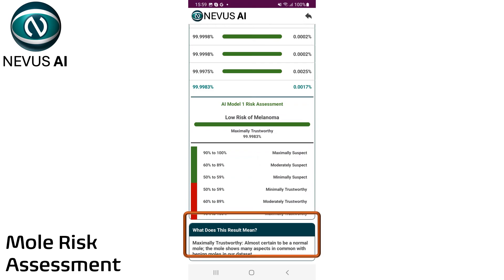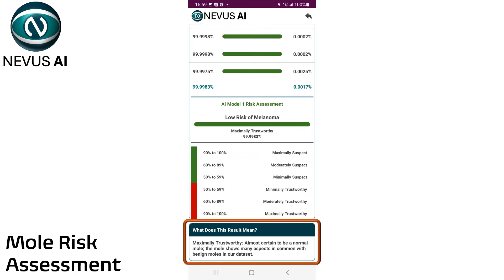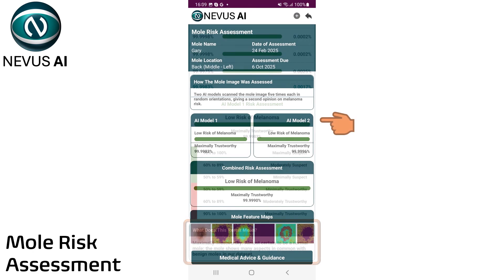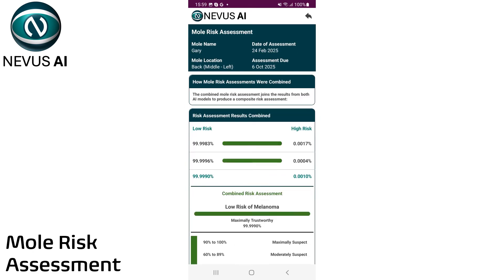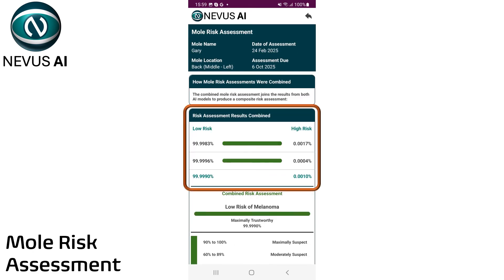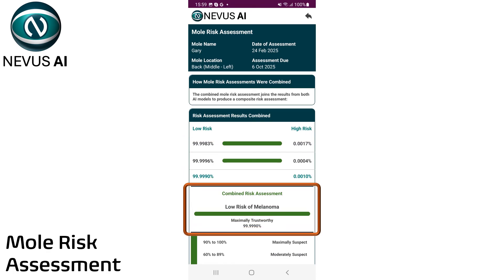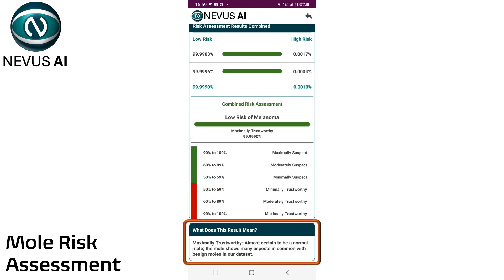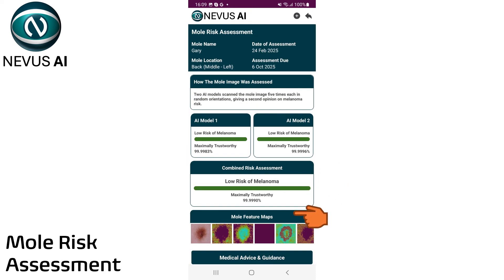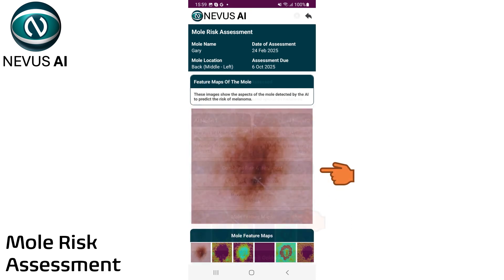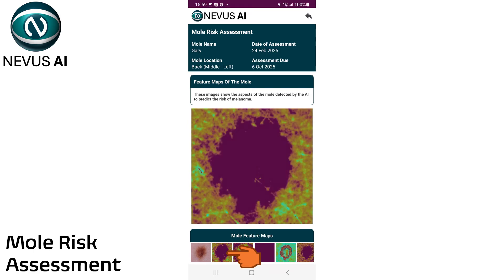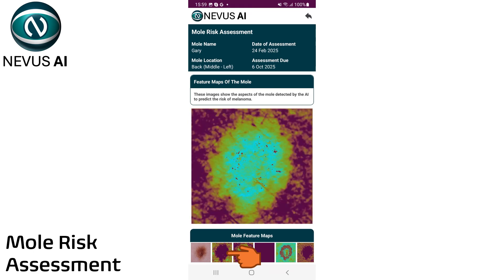Then scroll down to see what that score indicates in terms of the risk for melanoma. Tap on the combined risk assessment to see how results from both AI models were used to provide a composite risk score for melanoma. Tap on the images section to see the feature maps generated by Nevis AI in more detail. Use the menu below to flip through the feature maps.